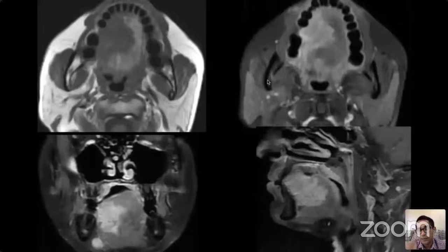In this particular case, there's a large volume disease which is crossing the lingual raphe. There's contralateral spread of the disease. This is definitely a stage T4A disease. There are ipsilateral enhancing nodes, some break in the cortex, with an edentulous socket at the level of the tumor, which probably means there's involvement of the marrow also. And this disease is abutting the anterior cortex with erosions along the anterior cortex as well.